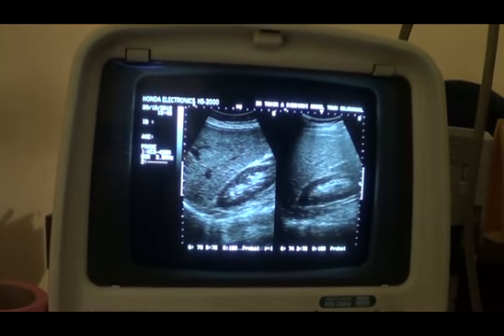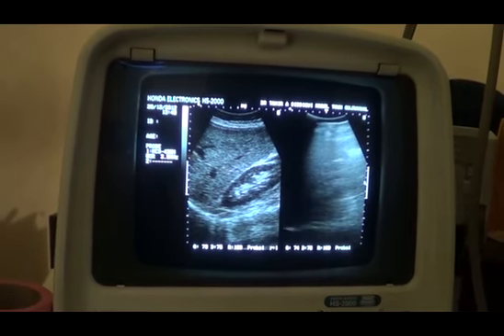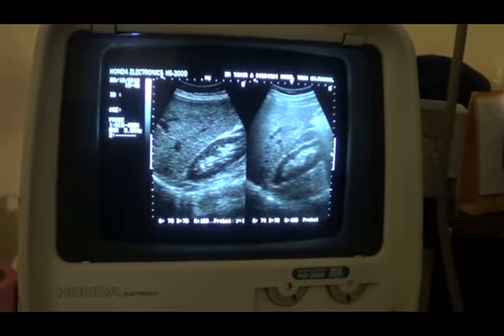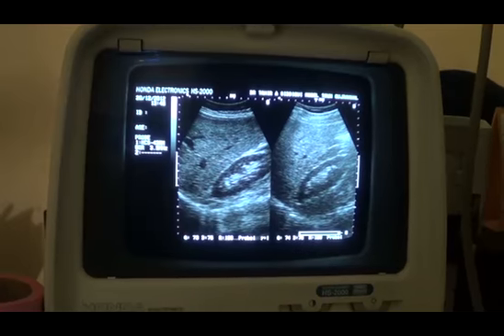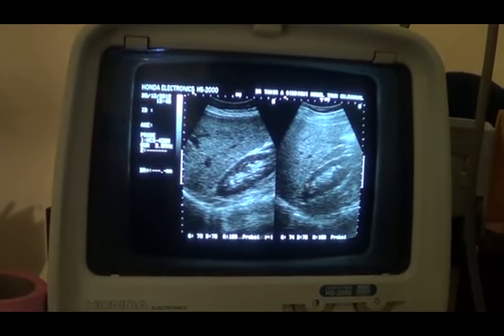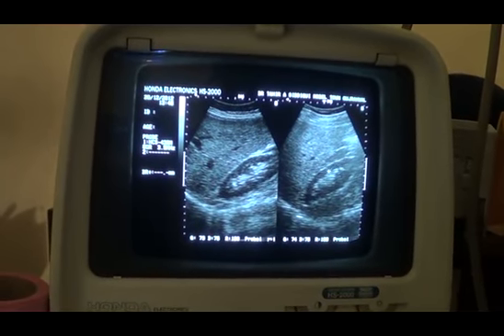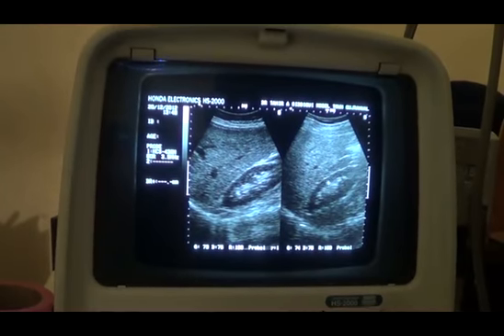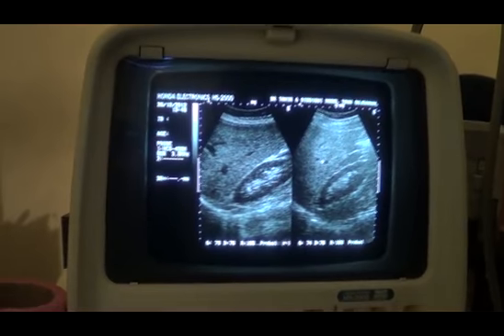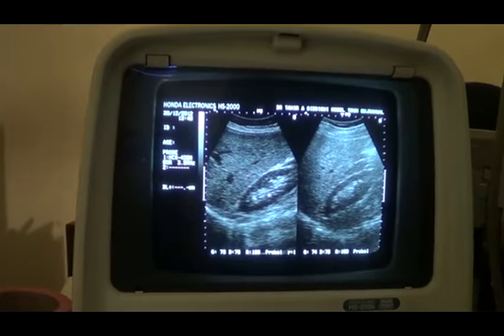And you see that this liver shows the same findings as we saw here, that the echogenicity of the kidney is less compared to the adjacent liver parenchyma, but the echogenicity is more as compared to the expected normal.